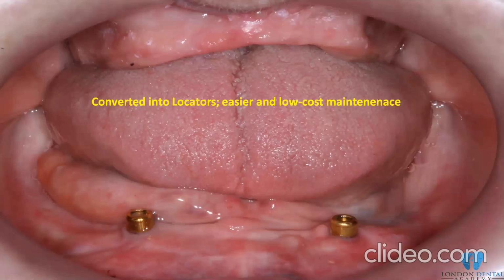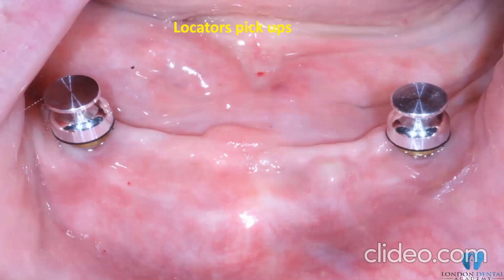I did not make them that high for many reasons, mainly to accommodate the space and reduce the fracture possibility in the area, and also many other reasons, which I will skip given my time. Try to get 2 to 3 millimeters supragingival, that would be sufficient. Don't get them long, don't get them short though, the locator abutments. And then you start picking up the impression by closed tray technique as usual.